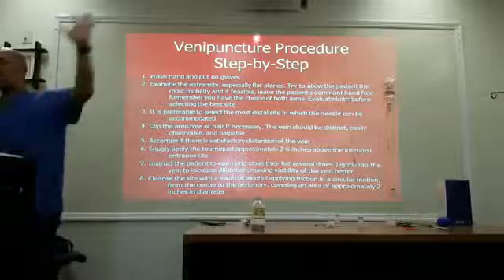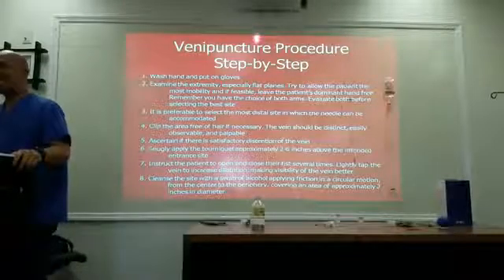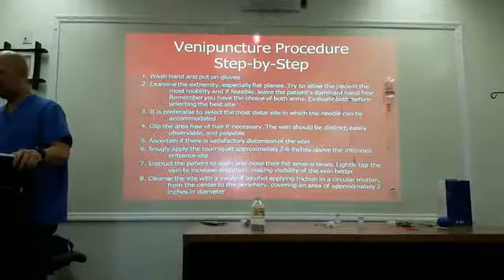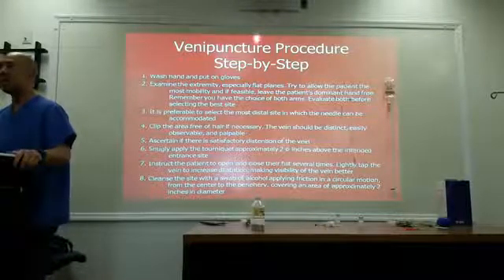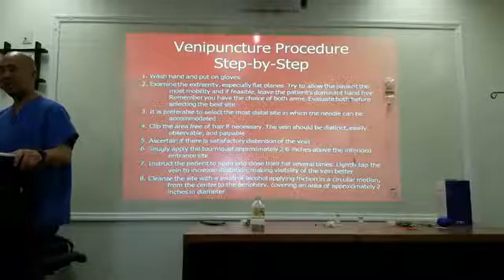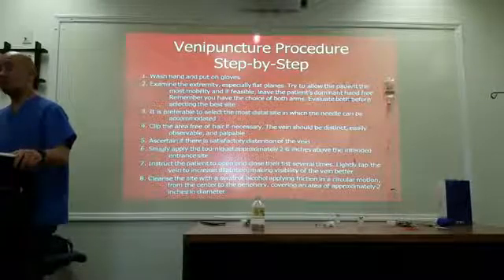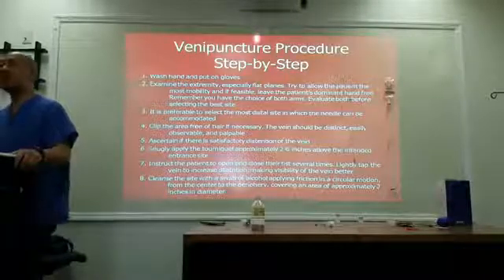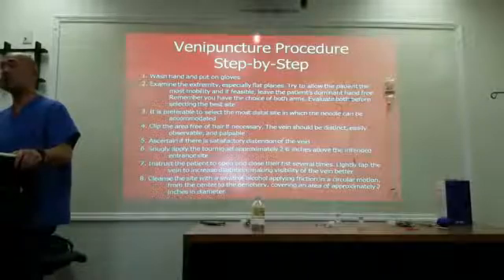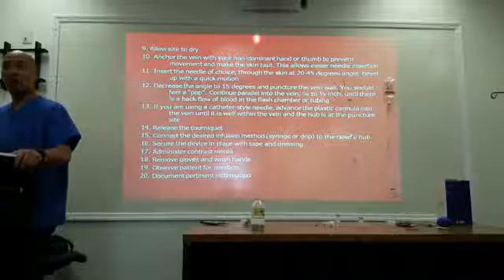Instruct the patient to open and close their fist several times. Lightly tap the vein to increase dilatation, making visibility of the vein better. Cleanse the site with an alcohol swab, applying friction in a circular motion from the center to the periphery, covering an area of approximately 2 inches in diameter. Again, allow to dry. Don't blow. Don't fan.